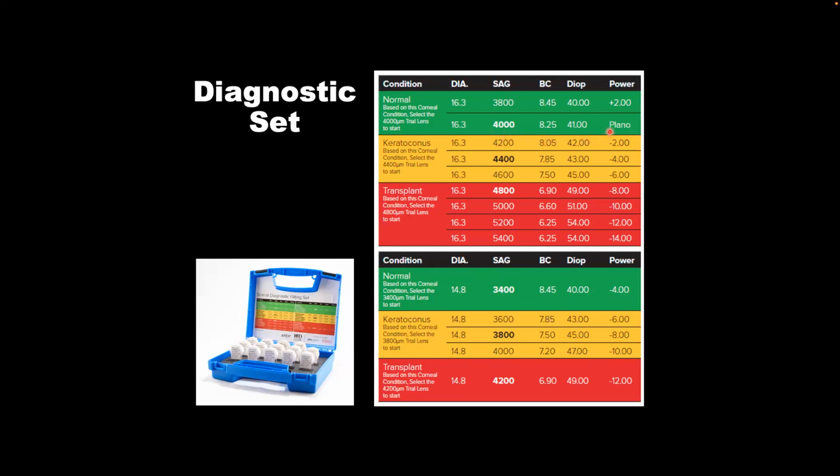with this being the actual power of the lens, and you can just add the final power, or you can just send the over refraction. I don't know about you, but we usually do just the final power, right? It's less confusing for the lab, just having the final power. And I know Ilker has sent final powers, so that's very useful.